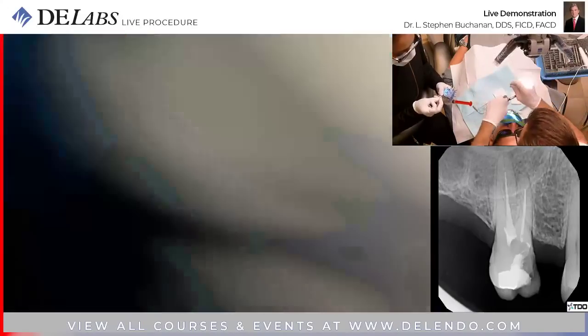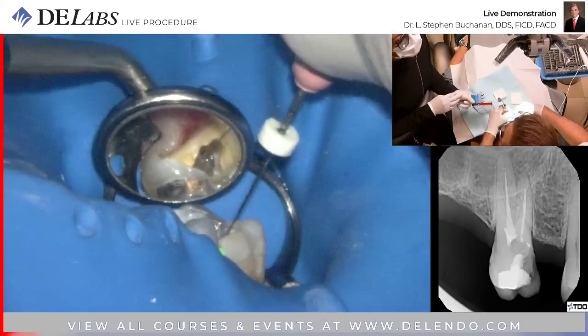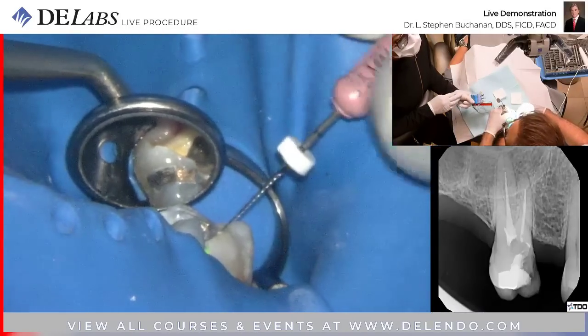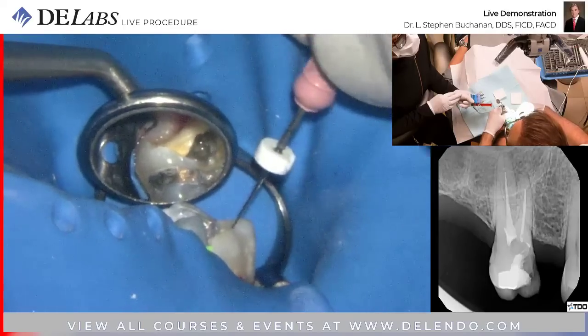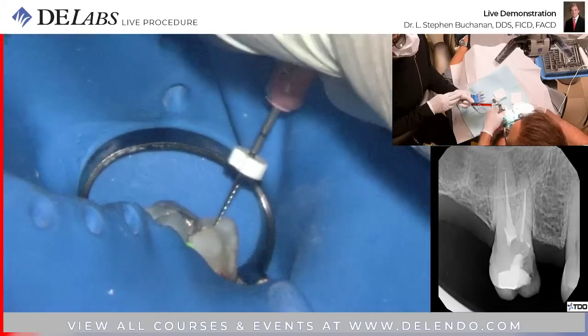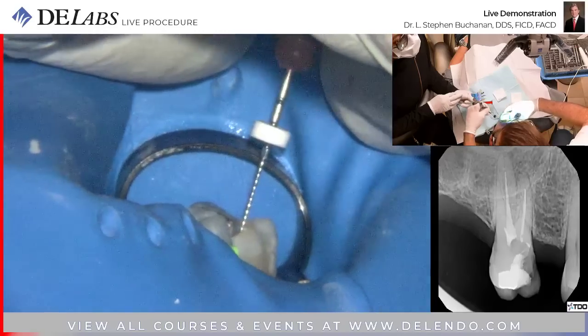Now, this is what I get for saying it probably was going to be an easy case. It is a straightforward case. We're just wanting to treat every little detail part of this anatomy. Okay, so we're in there. We should be around the impediment.